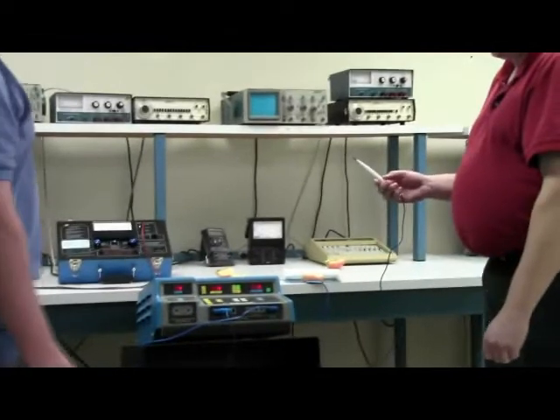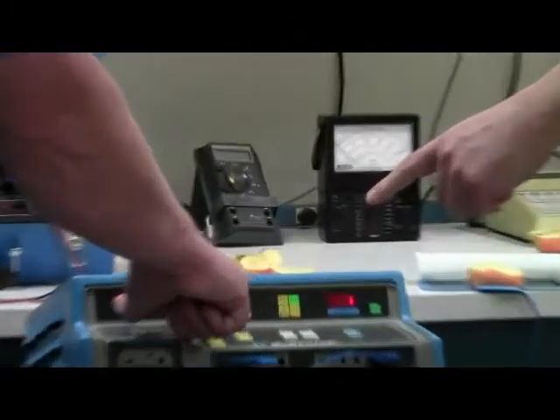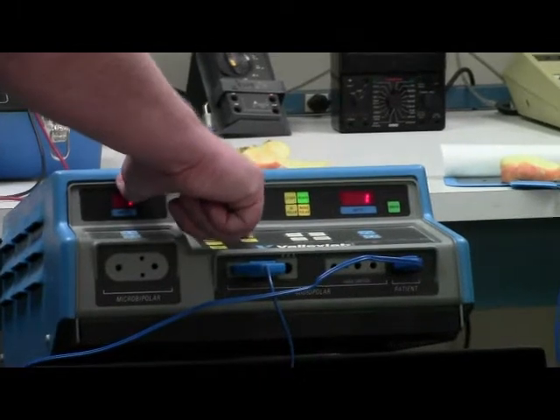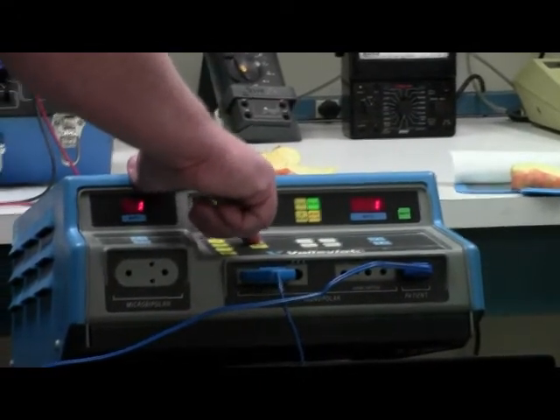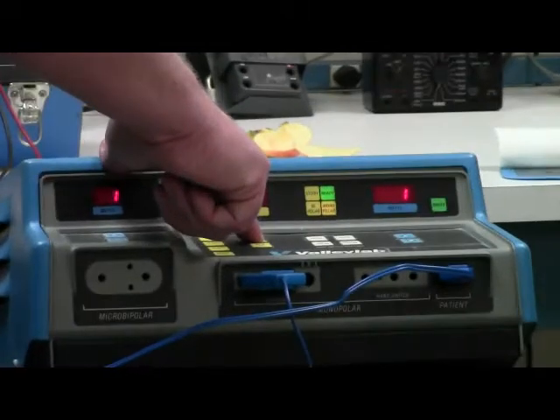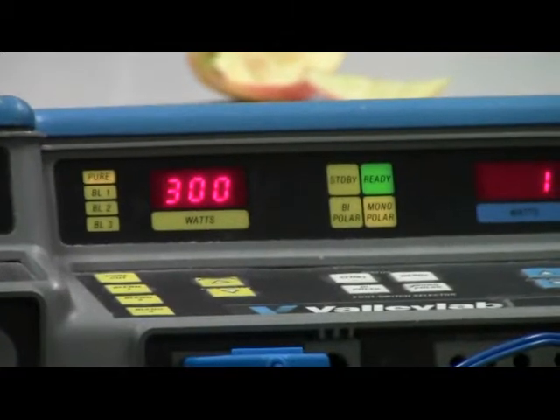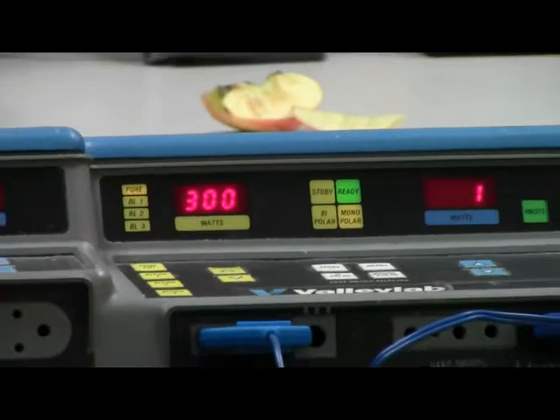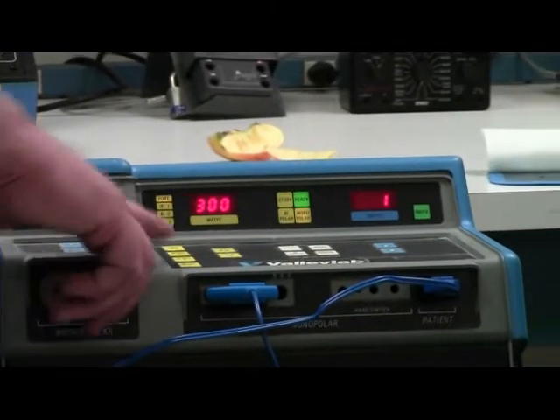We're going to select on status the ready mode. Then we'll start with the cut side first, selecting pure cut. Ted is going to adjust the manual up key to get to the maximum setting of 300 watts. We also have three blend button selections, which are like presets.